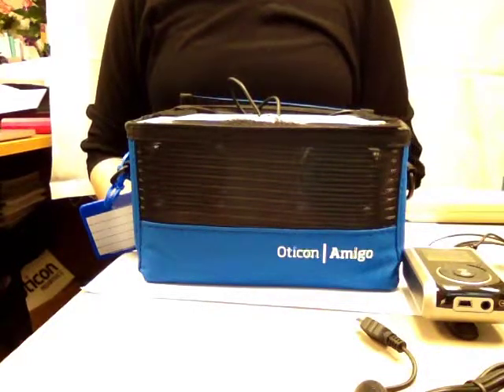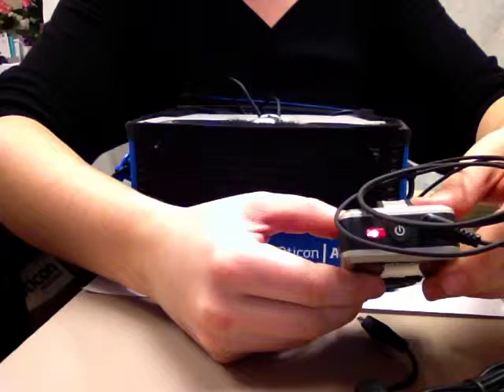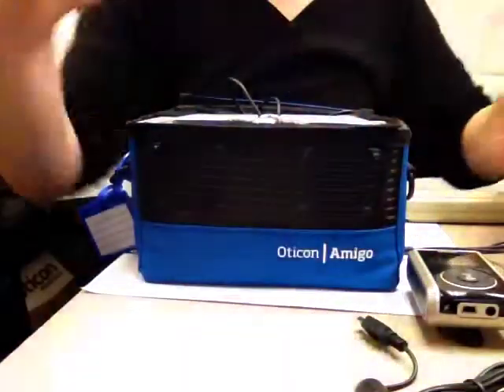Look at the light on the top of the Oticon T20 transmitter. It should be red. The Oticon T20 transmitter should be turned off to charge it each night. If it is not charged, charge it again and try again.